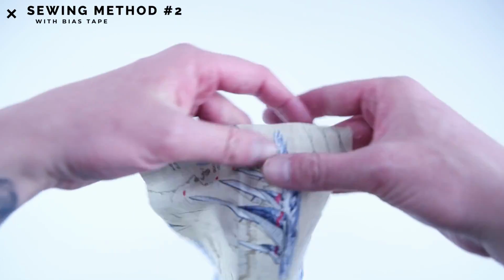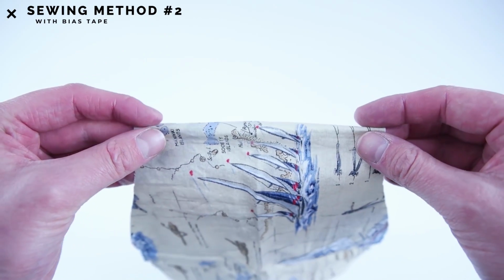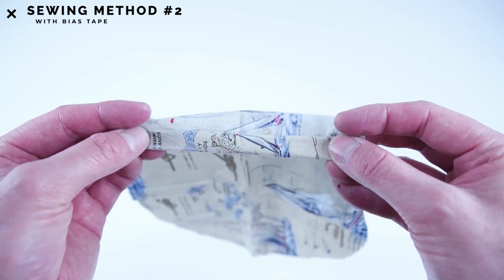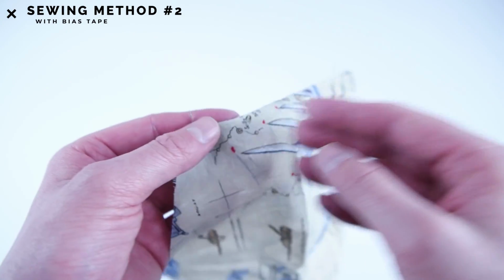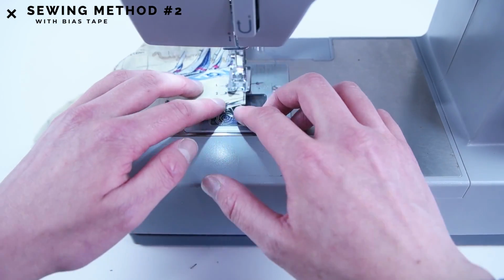Moving on to the top main panel, we're going to fold the back edge over twice on the marks indicated on the pattern. And elastic is optional here. If you do add elastic, cut it at 3 to 4 inches and stretch it across on the inside of those layers. Throw a few pins in to keep all the layers in position and sew as close as you can to that inside edge.